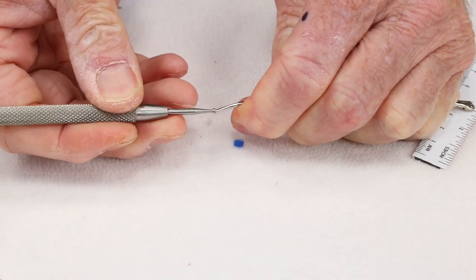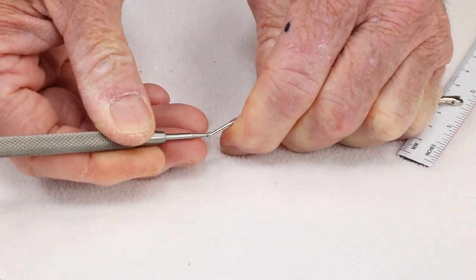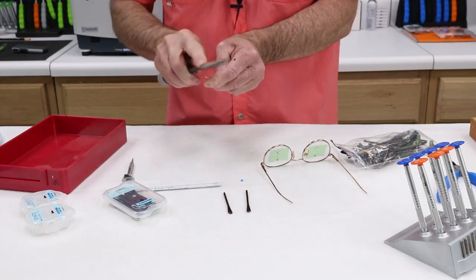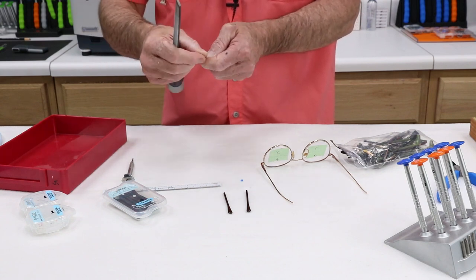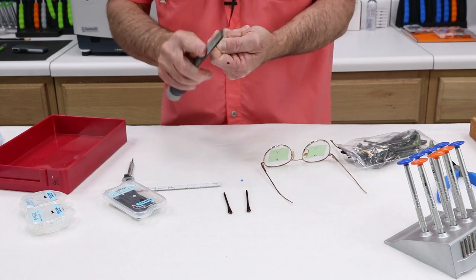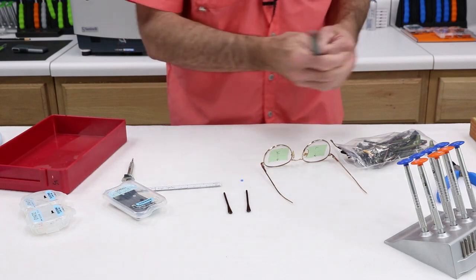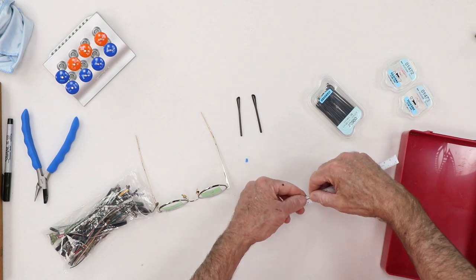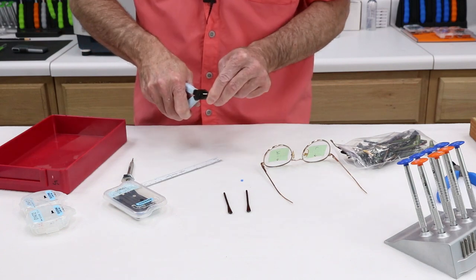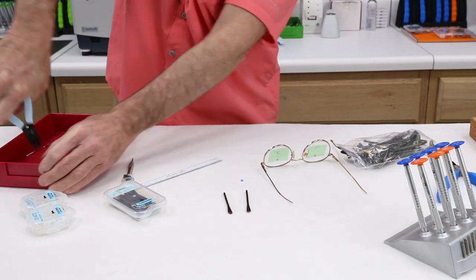Let's see if my deburring tool can do it. That helps. I've got to make sure I've got nothing to catch, because when I put this into that temple end and start pushing it through, if there's anything that can snag, this is not going to work very well. Time to cut another 10 millimeter piece off. Looks good. Put it in my tray.